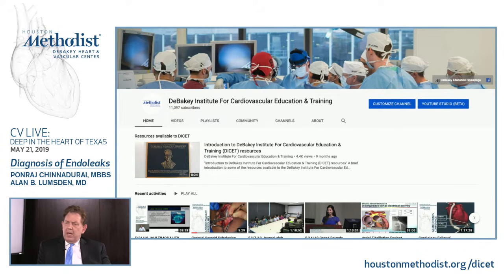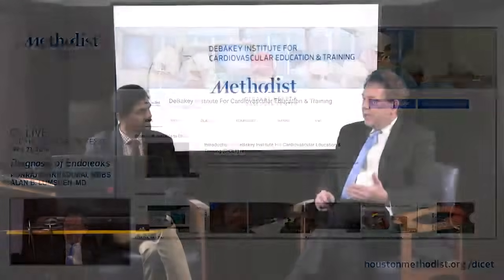And now, as I hand off to Ponraj, I want to acknowledge Dr. Suman Chang and the techs who are involved in the CT in the Cardiovascular Imaging Center, because they're heavily involved. I think that's a theme you're going to hear about: the communication with the techs and with the physicians who are interested in the diagnostic phase of this, to try and acquire these scans. This is not just the generic scans. So Ponraj, why don't you tell me a little bit about how we should be imaging before we get into the interventional suite to try and take care of these endoleaks?